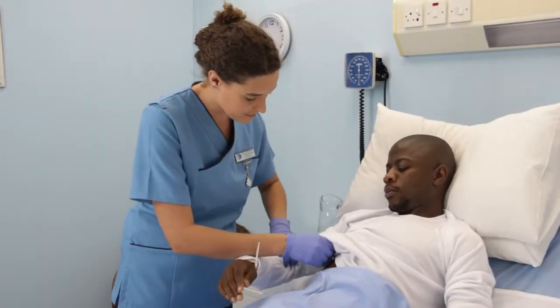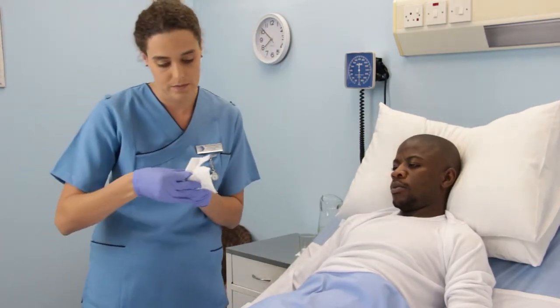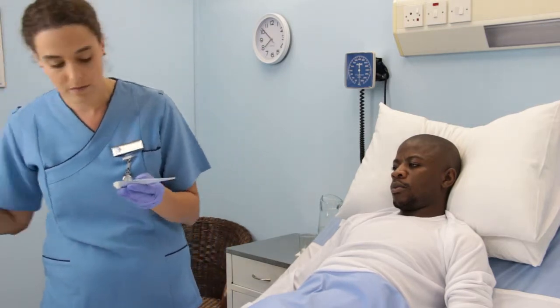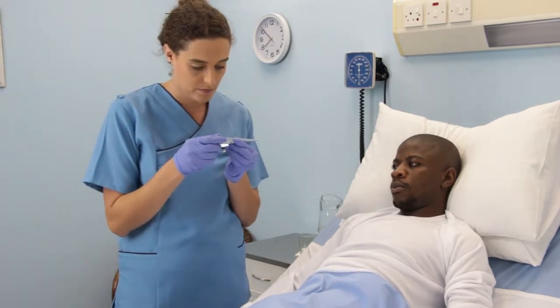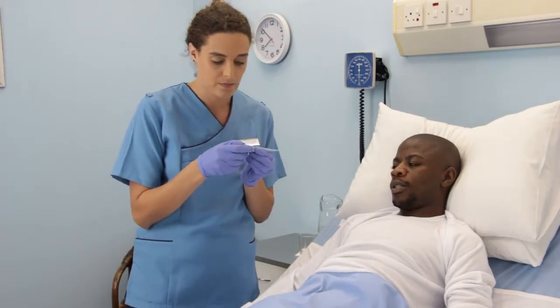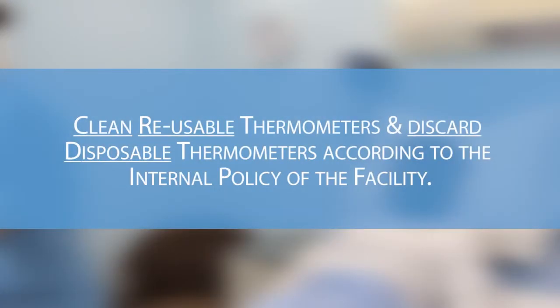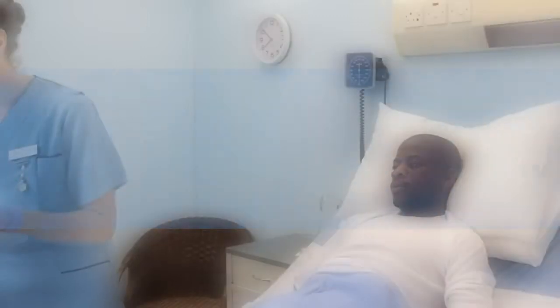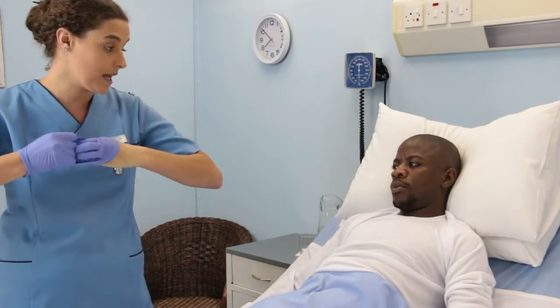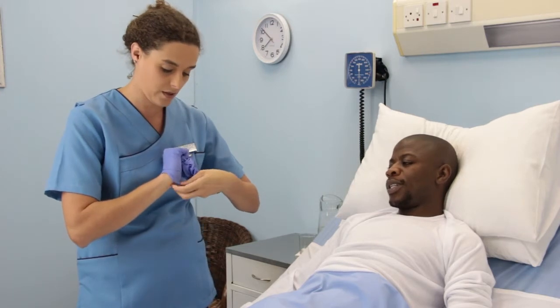Remove the thermometer. Remove and discard the protective cover or wipe the thermometer dry with a clean tissue. Read the temperature immediately. Switch off the digital and electronic thermometers after use. Clean reusable thermometers and discard disposable thermometers according to the internal policy of the facility. Remove gloves if any were used and discard thereof according to the internal policy of the facility.